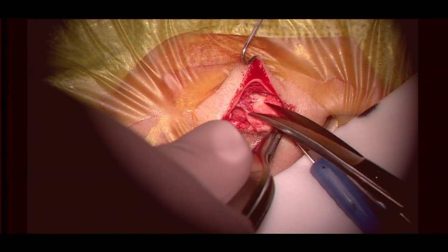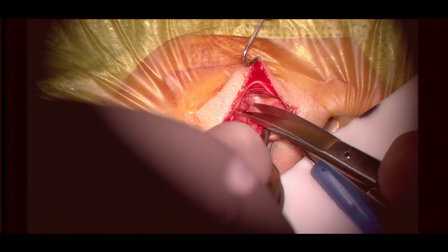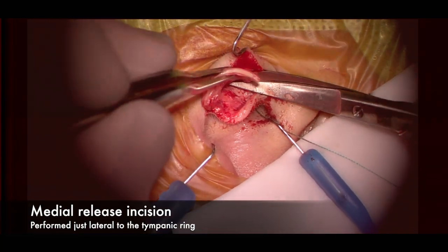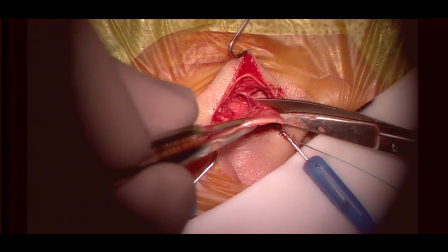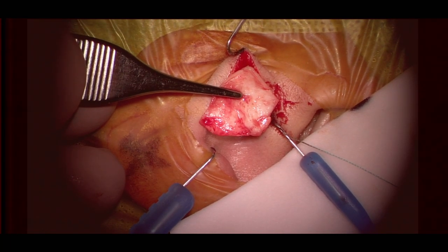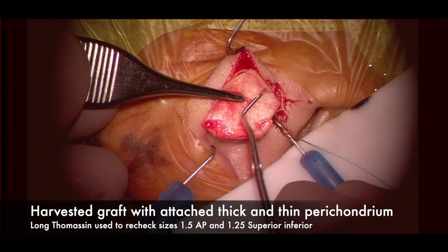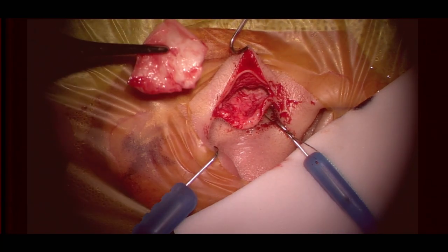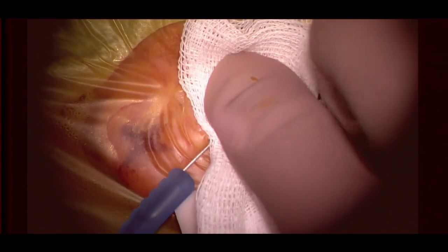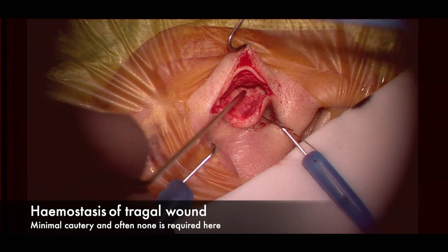Releasing the free superior margin as high as possible, then the thicker inferior contiguous margin is pulled superiorly and cut as inferiorly as possible to maximize the cartilage graft. We end up with quite a nice substantial graft that should fit most tympanic membrane sizes. Transecting medially almost at the tympanic ring, with not much bleeding at the tragal harvesting site. The long Thomassin is used again to check the anteroposterior and superoinferior distances, with the thick perichondrium anteriorly on the convex side.